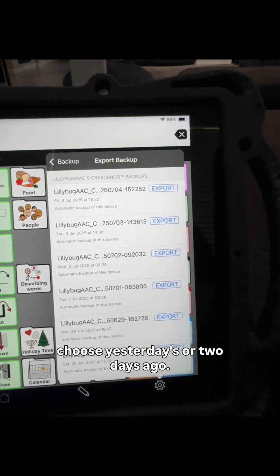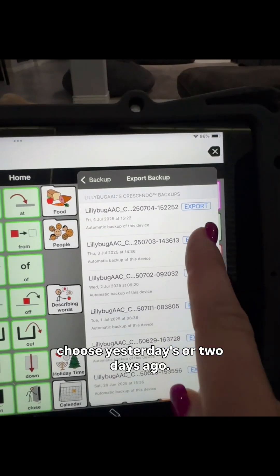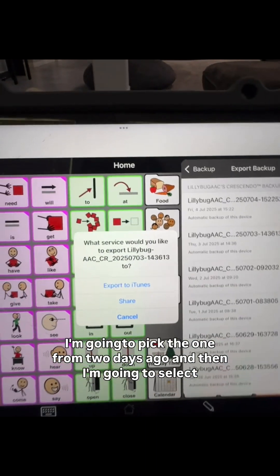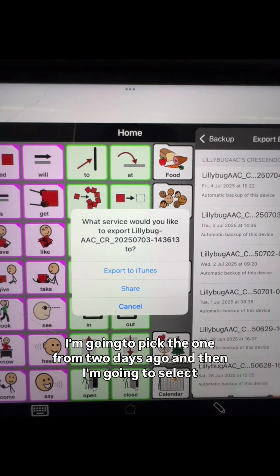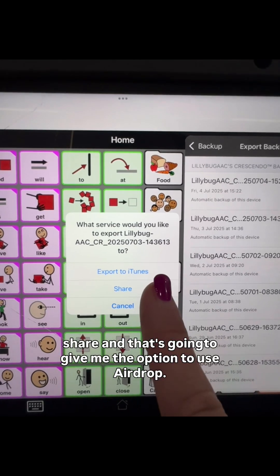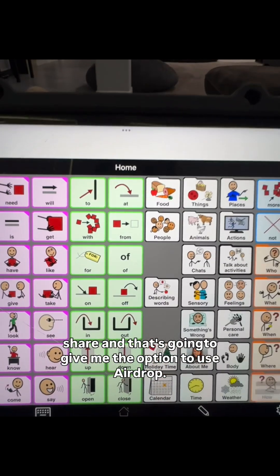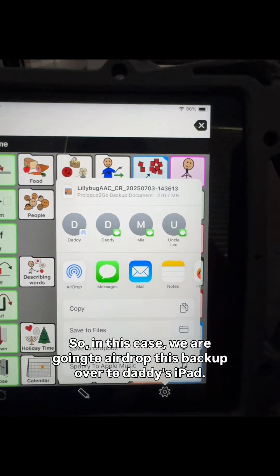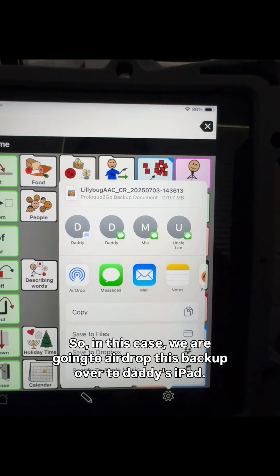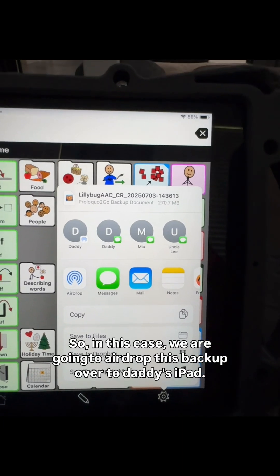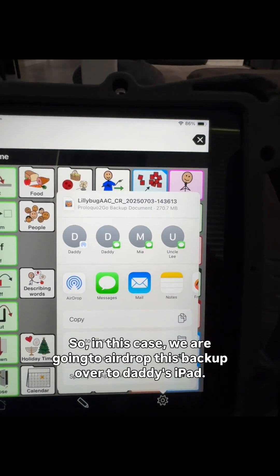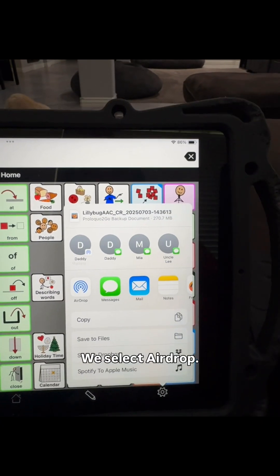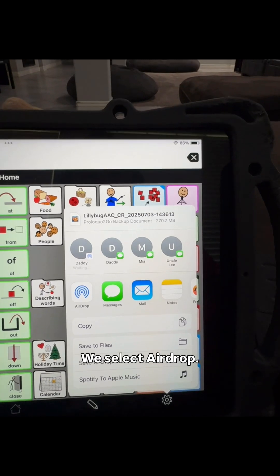So I can hit Export Backup, and then I can choose a date — like yesterday's or two days ago. I'm going to pick the one from two days ago. And then I'm going to select Share, and that's going to give me the option to use AirDrop. So in this case, we are going to AirDrop this backup over to Daddy's iPad. We select AirDrop.